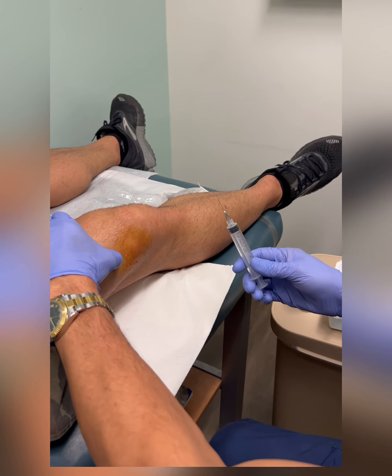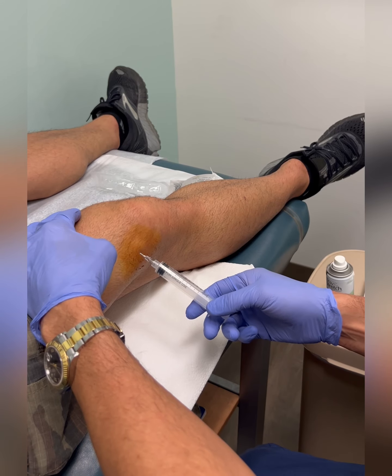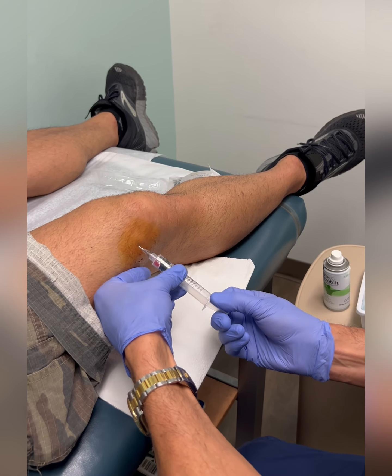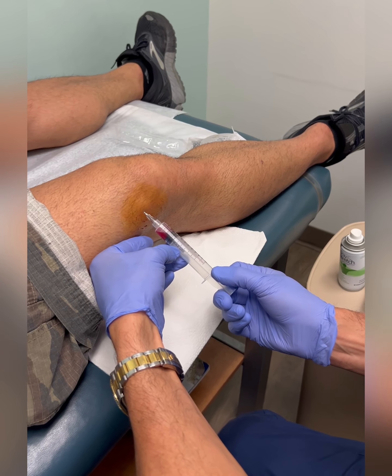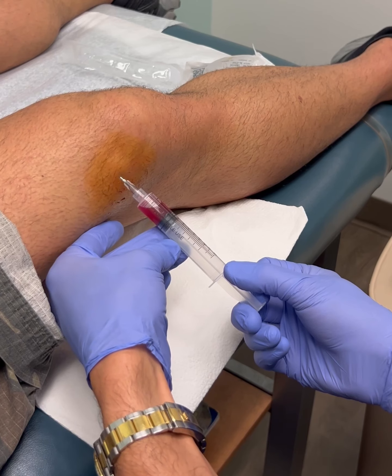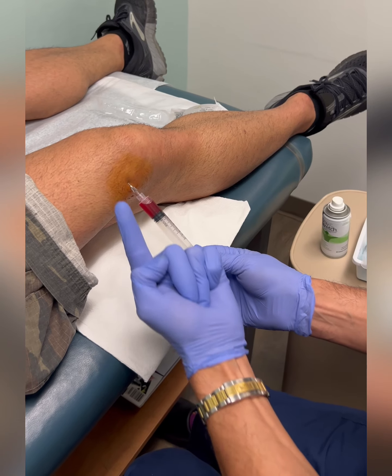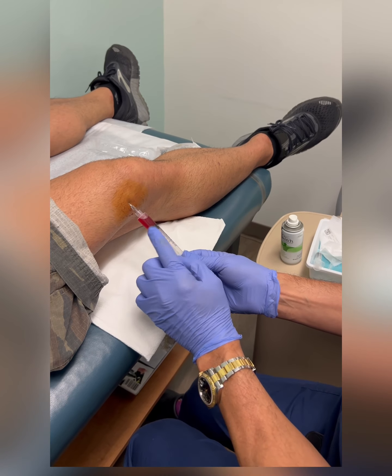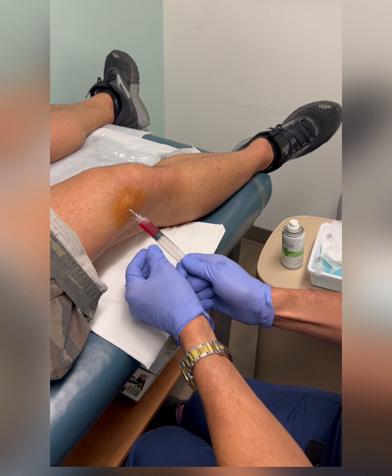Give it a little squeeze here with my thumb, a little shake. Now we pull. Was that okay? Yes, fine — did you feel that? Nope. And as expected, it's blood. Notice my hand orientation — I'm aiming up, slightly upward.